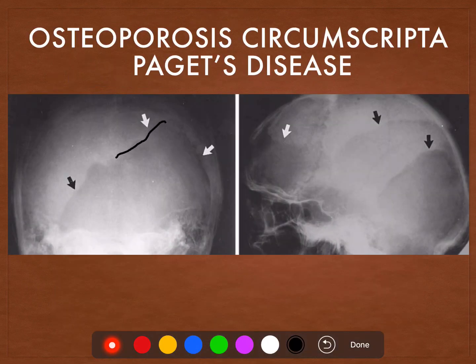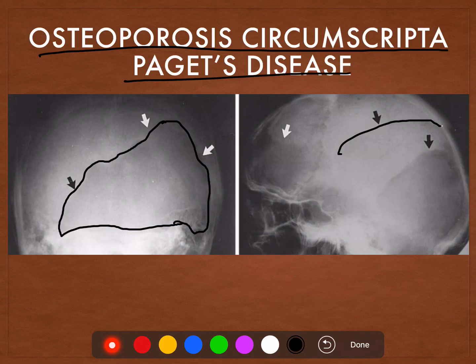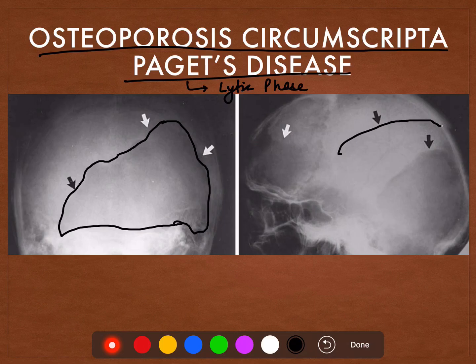Here we see this large well-defined lytic lesion in the skull. This large well-defined lesion is known as osteoporosis circumscripta and is characteristic of Paget's disease — to be precise, it is characteristic of the lytic phase of Paget's disease. Paget's disease has three different phases: the lytic phase, the mixed phase which has both lytic and blastic activity, and then the sclerotic phase.